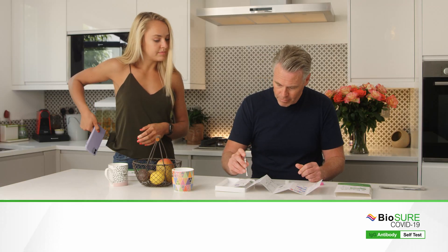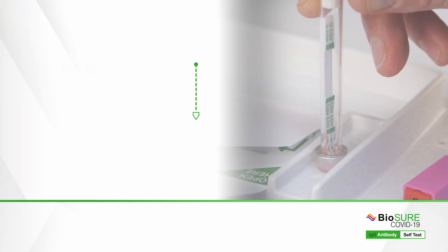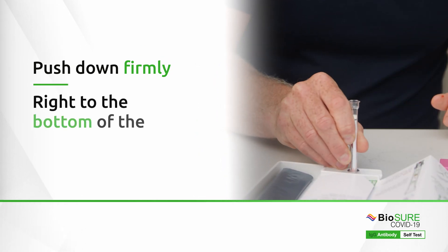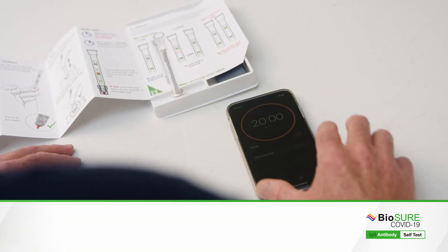Now push the tip of your testing device through the foil lid and into the buffer pot. Push down firmly until you cannot push any further — you want the tip of your testing device to go right to the bottom of the buffer pot. Now start your timer for 20 minutes.